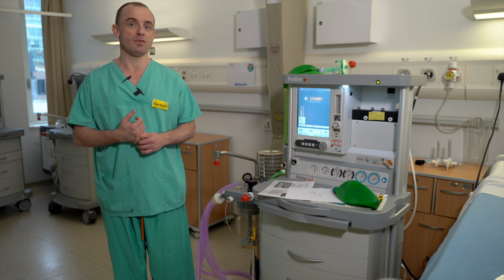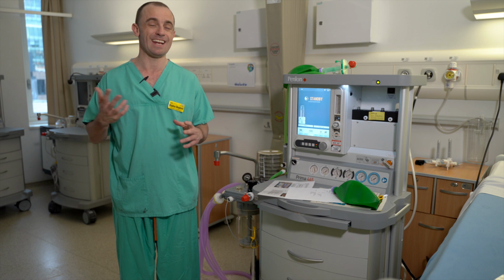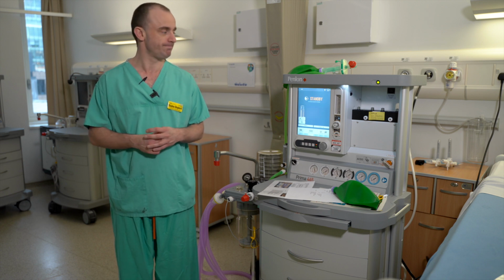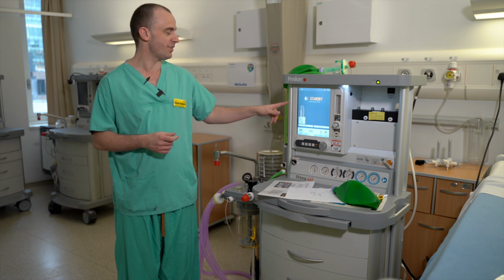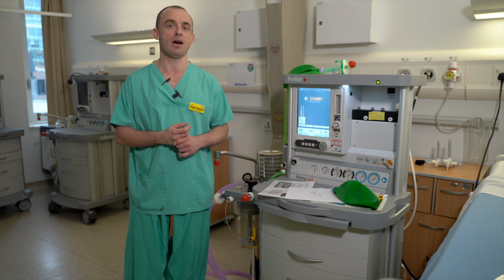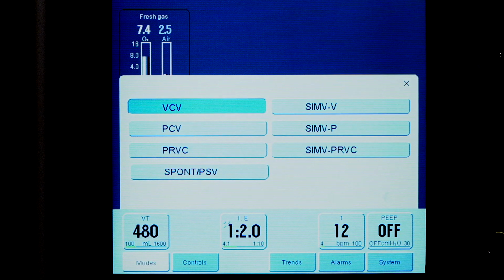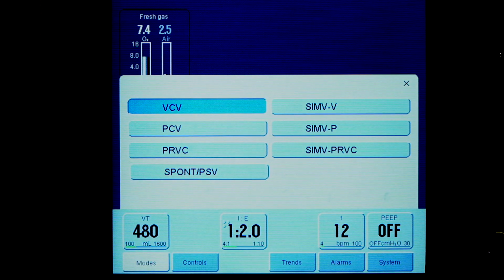10 litres per minute, however, will cover the majority of people for the majority of initial setups, and it can be adjusted later on. So we've set our initial gas setup. The next thing we want to do is set our mode. And if you press mode, you'll see that it has a number of modes which should be pretty familiar to most of us working in intensive care.